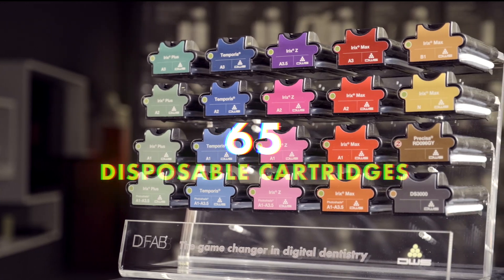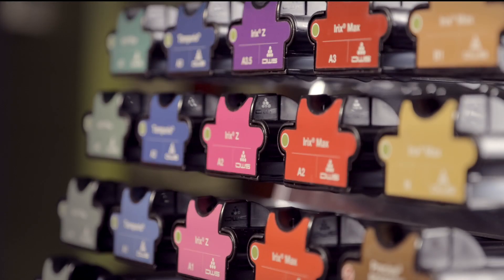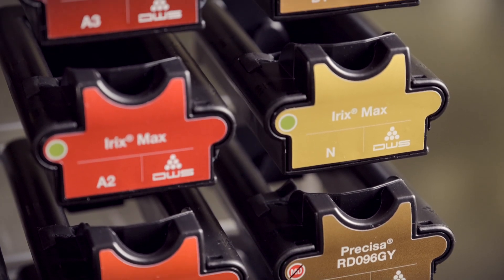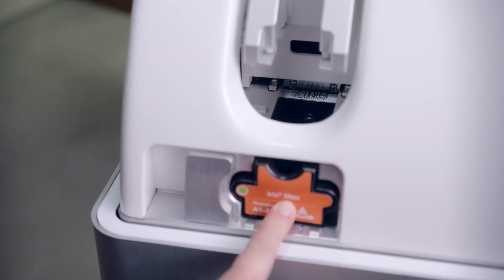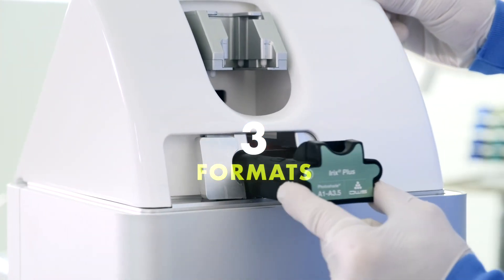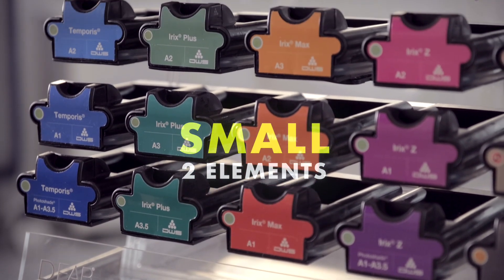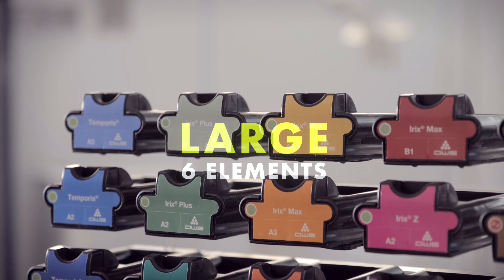The range of 65 disposable cartridges available for D-Fab printers is by far the widest on the market, and is set to expand further as the important research into more complex materials continues. To minimize operating costs, D-Fab cartridges are available in three formats: small, suitable for printing up to two elements; medium, up to four elements; and large, up to six.